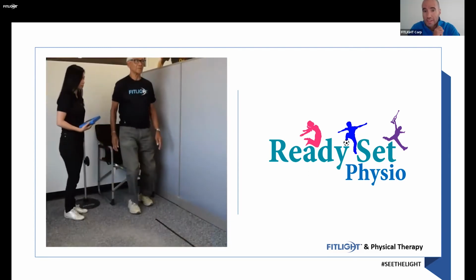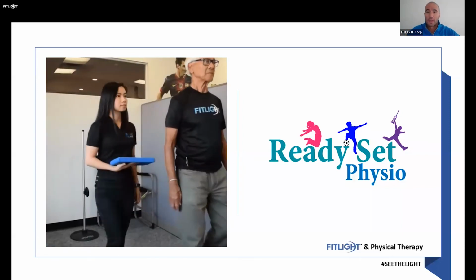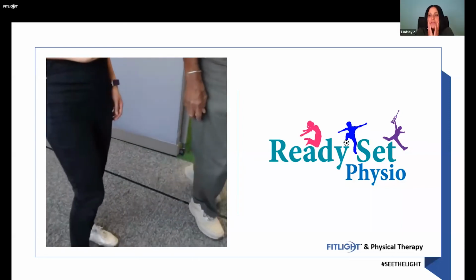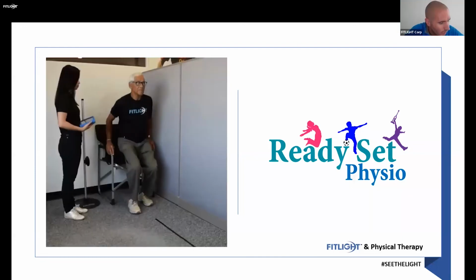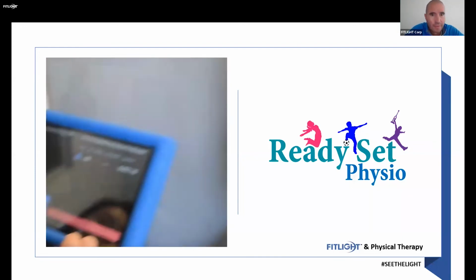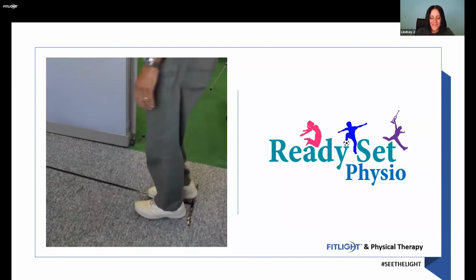Typically, what does TUG stand for? Maybe for the people that are not physical therapists, can you explain what TUG stands for? Oh, you put me on the spot. I don't remember. We just call it the tug test. It's something with timed up and go. Timed up and go. Yes, thank you.